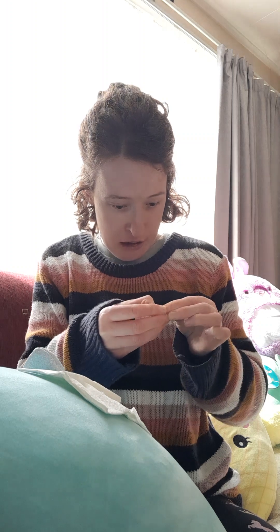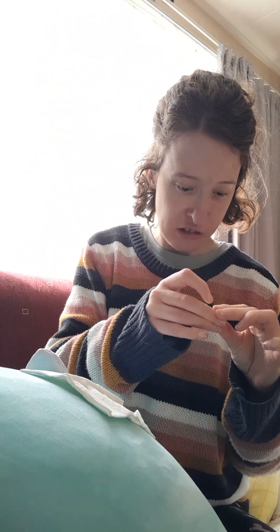And now I'll take this off, because I don't have straight hands.